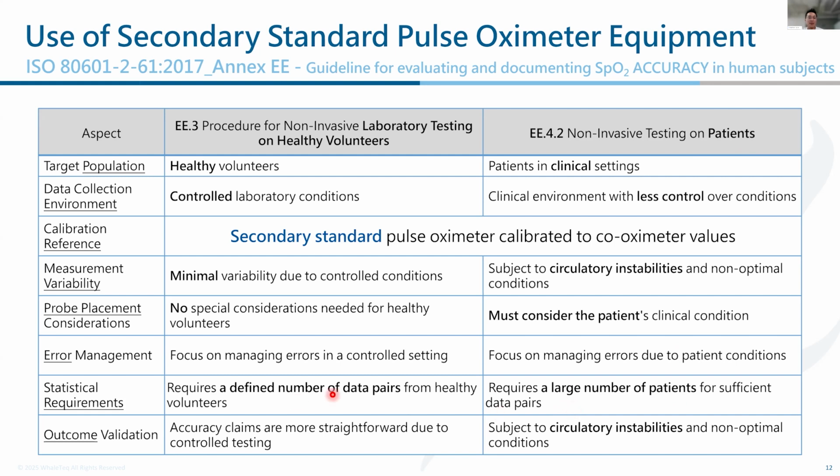But in the lab testing, because everything is controlled, with minimum variations, a limited or just a defined number of subjects can speak for itself. So it's much more straightforward.